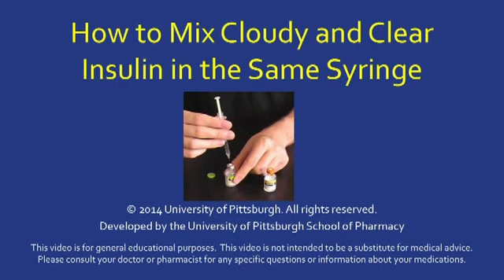This short video is a supplement to the insulin vial instruction video. I will describe the steps needed to mix cloudy and clear insulin in the same syringe before injection. Mixing insulins is a technique to reduce the number of injections made each day.